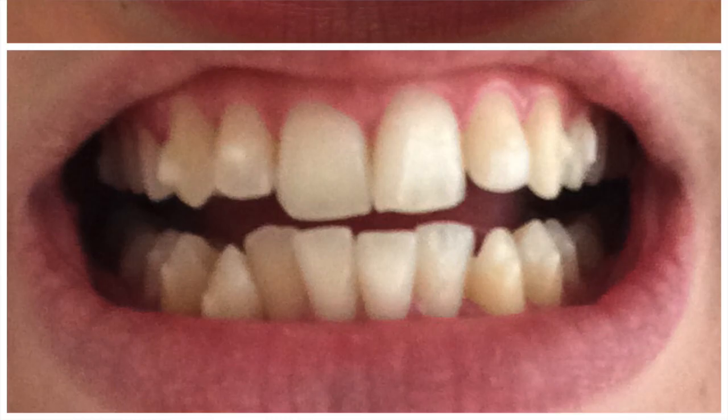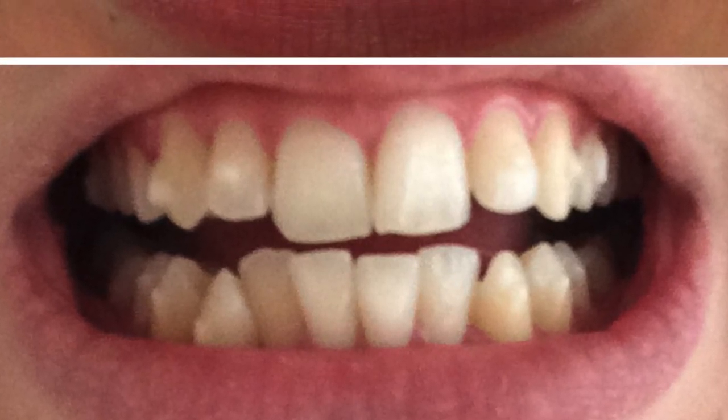I'm now on my ninth aligner — this one here — out of 34. To say that I'm still quite at the beginning of my treatment, I am so surprised at how much my teeth have already moved. I've been taking pictures throughout this first four months and I can't believe the difference I can see. I'll insert a picture of when I very first had the aligners fitted and now — you'll also see in that picture that I have the buttons attached. I definitely think that in real life you can see more of a difference than in the picture, but to say I'm only on my ninth aligner, I'm so happy with the results so far.